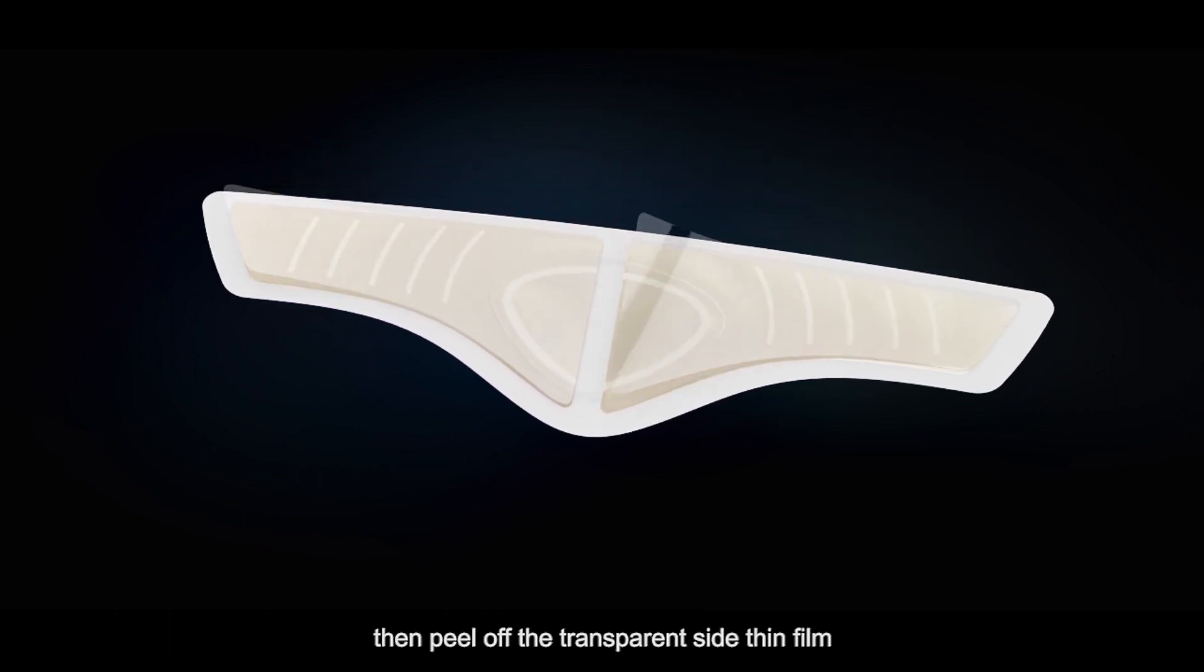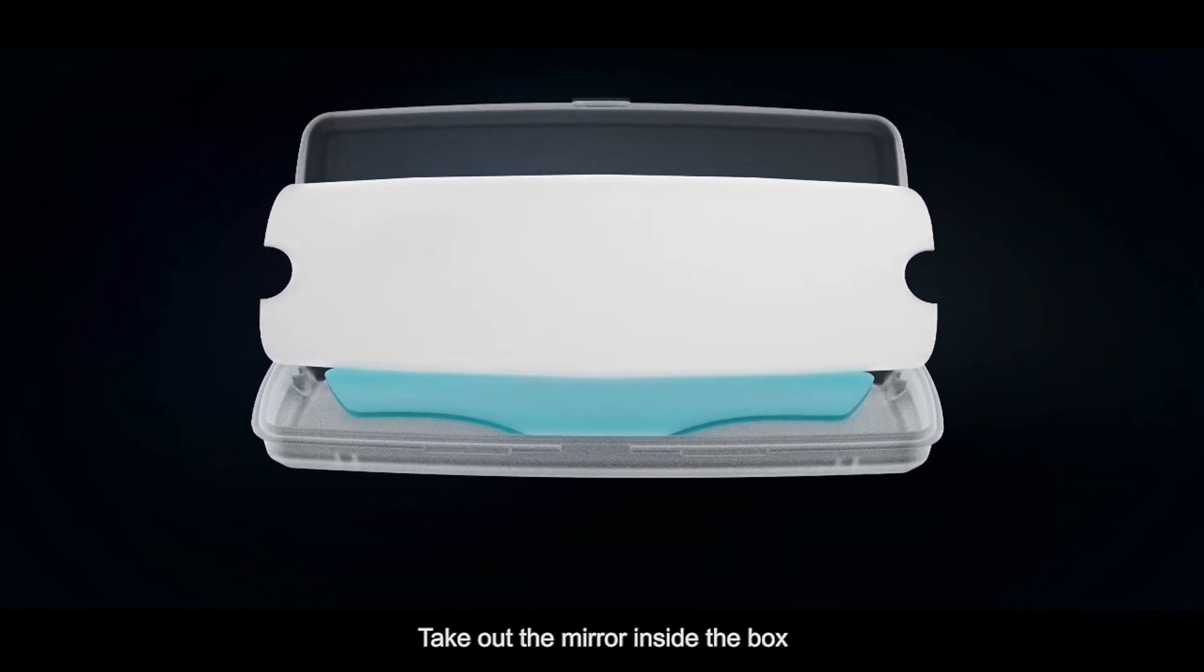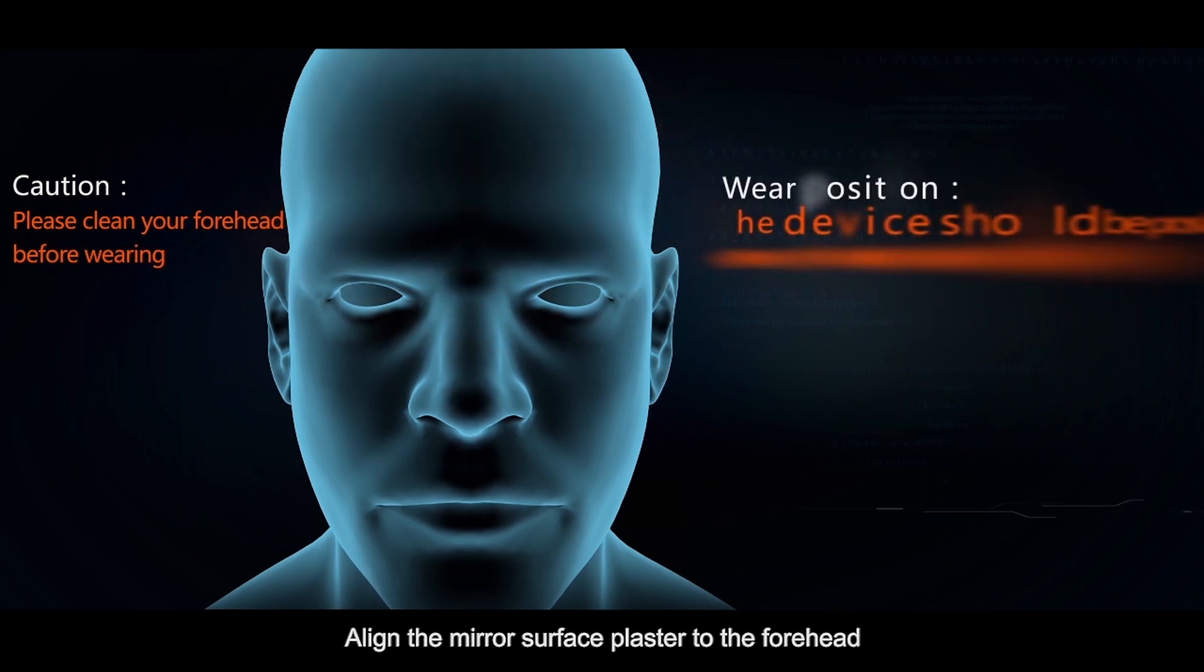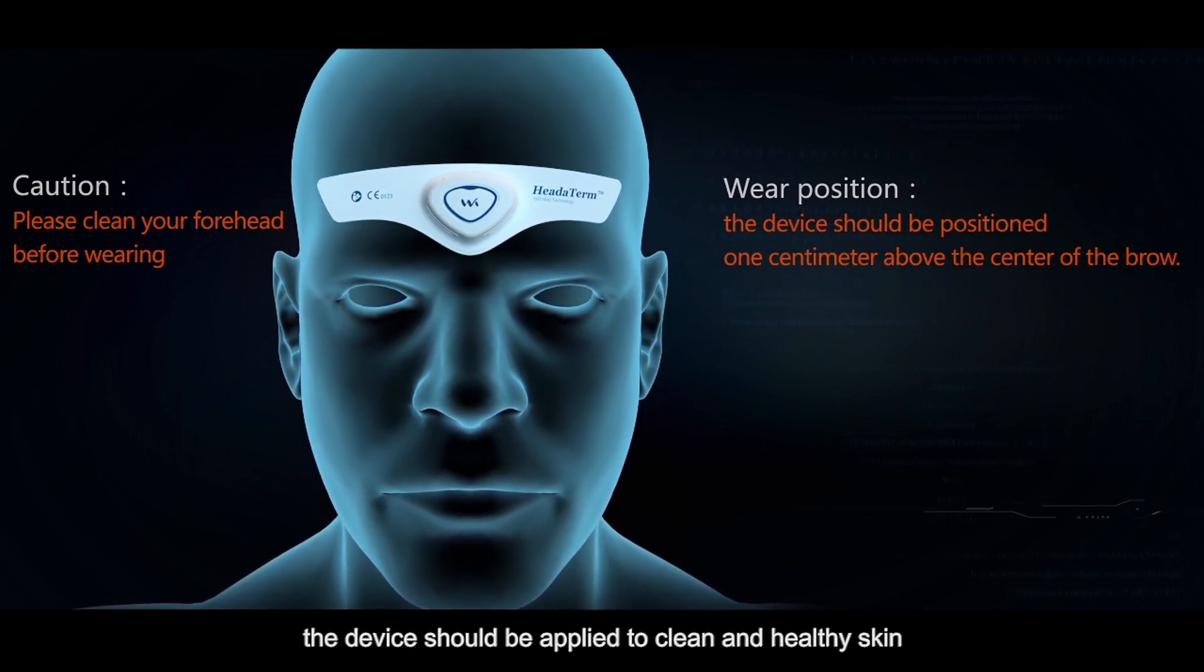Peel off the transparent side thin film. Take out the mirror inside the box. Align the mirror surface plaster to the forehead. The device should be applied to clean and healthy skin.